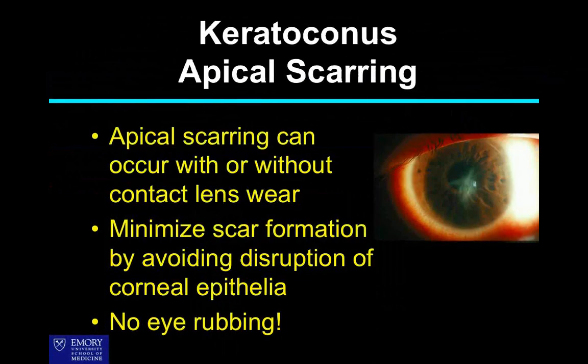Now I want to mention something about corneal scarring, because in keratoconus management it's very, very important to minimize corneal scarring and to realize that corneal scarring occurs with or without contact lens wear. Some believe that contact lenses are necessary to cause scars, and that's just absolutely not true. They can occur with or without contact lenses. However, having said that, an ill-fitted contact lens can exacerbate and propagate scarring.